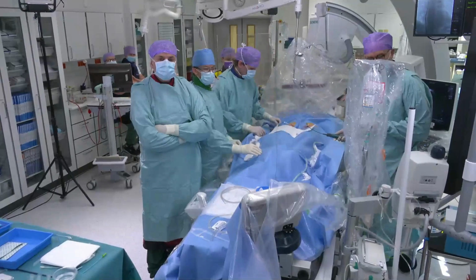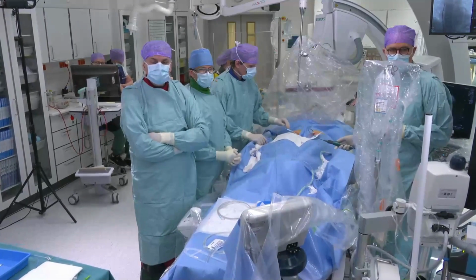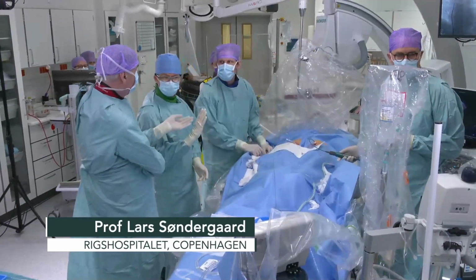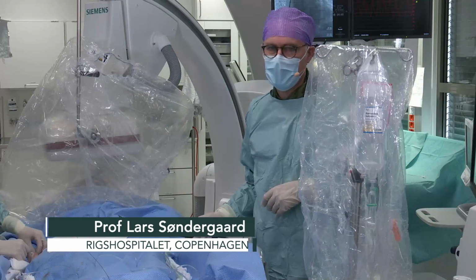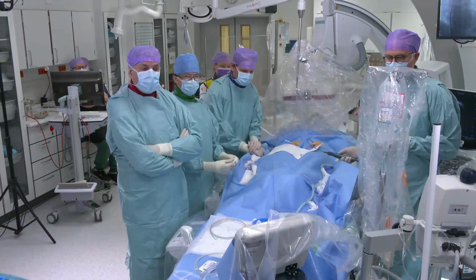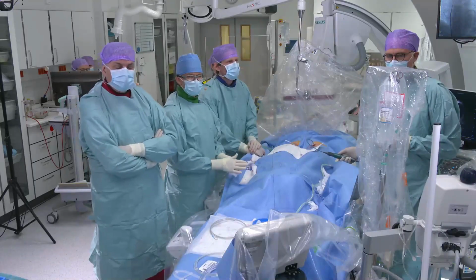So welcome to Copenhagen and this case where we're going to do a left atrial appendage closure. My name is Lars Sondergaard. I'm here with my two colleagues, Gintas Bilauskas and Ole de Bakker. And I also have Niels Weilstrup, who is our imaging expert, who's going to do eyes in this procedure. So before we start, let's see the case presentation here, the patient we have selected for this.